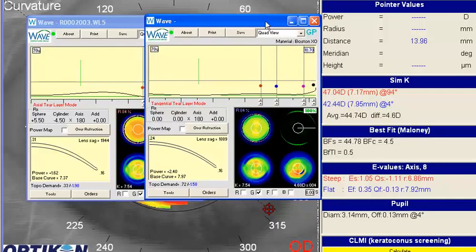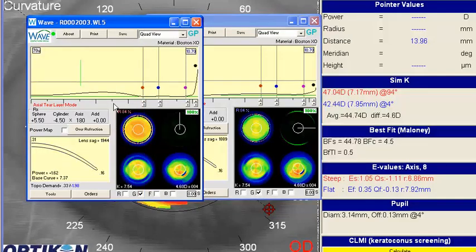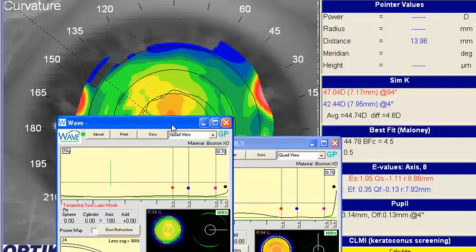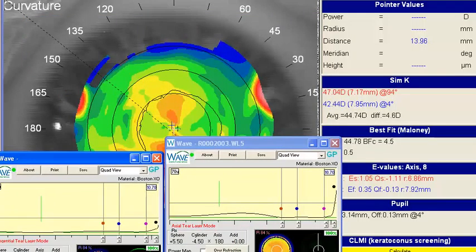So this lens, when we do not average the corneal cylinder, we get more like 3 to 3.5 or so diopters of corneal cylinder on the back surface of that lens, whereas this other design you only get a couple diopters. And so I think in your current designs, you may not be getting a true back surface representation of the cornea, it's actually a little flatter, and that's probably allowing this lens to rock a little bit more when you get off center on gaze.